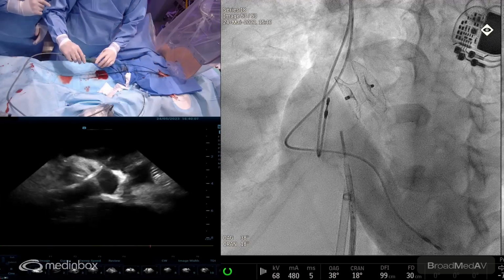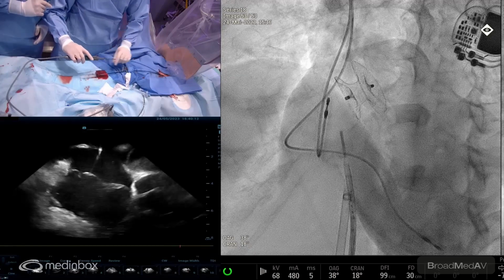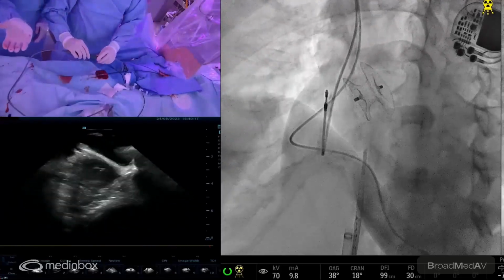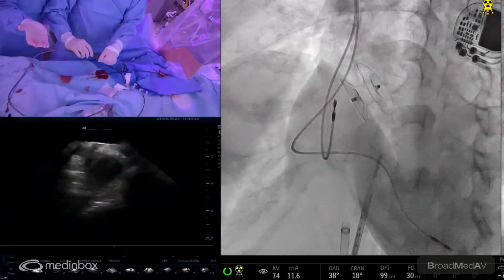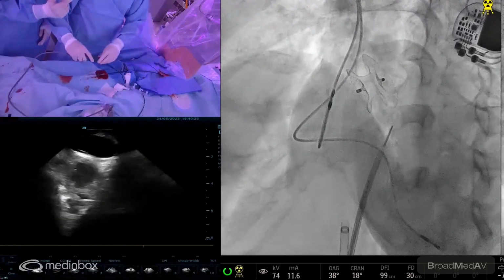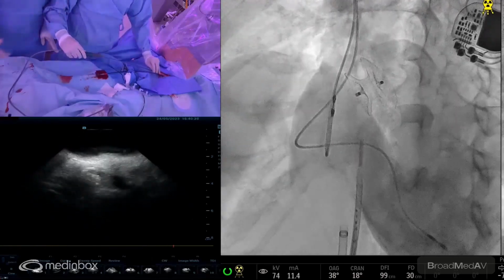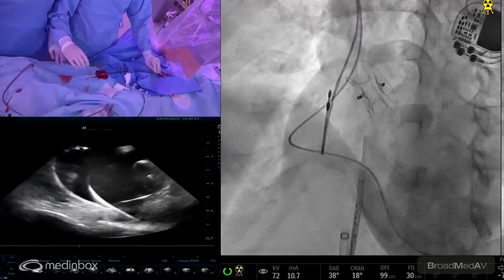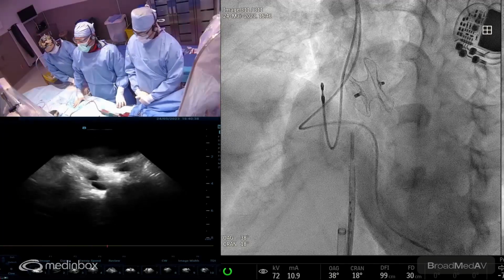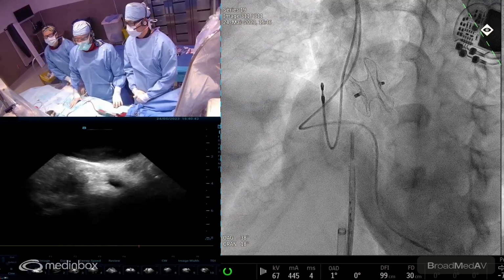Just give us 2 seconds and we'll be happy to answer the questions. It's almost finished here. We just need to finish at the end. So now we are seeing the pacemaker lead in the ventricle. Can you potentially flip it towards the ventricle? Difficult. Okay. Doesn't matter. Happy to answer your questions. Do you have any question?